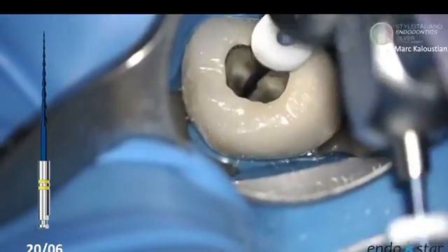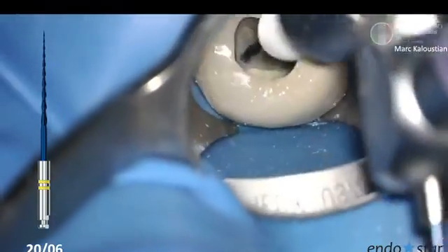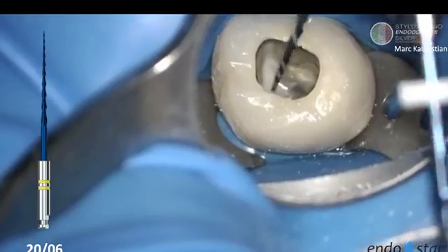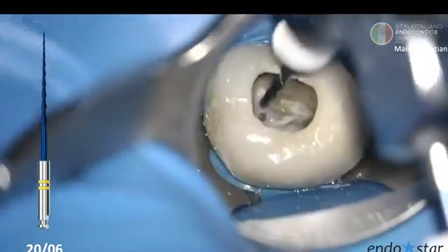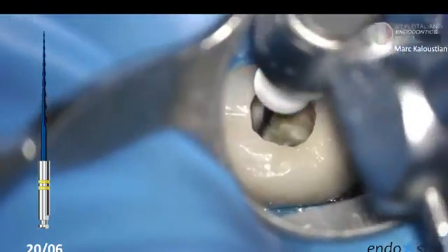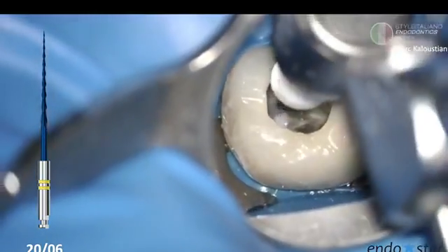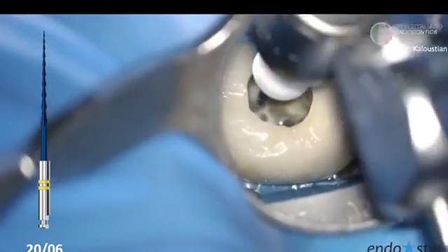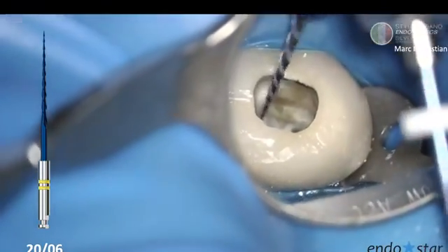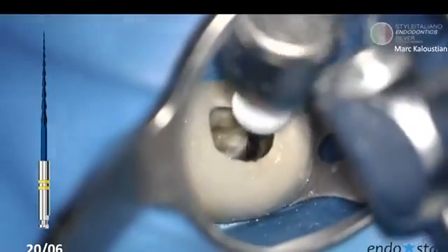And now we can use the 2006, which will be the final file in this case, because it is small canals and we don't want to enlarge it too much. What is interesting with this file is that I can use it in the brushing motion. So the brushing motion is excellent. Why? Because I have a small taper, only 06, I don't want to go larger, but in the coronal part I can do brushing. And by doing brushing in the coronal part, you see how much debris I am removing. I am enlarging the coronal part, but keeping the apical part very small.